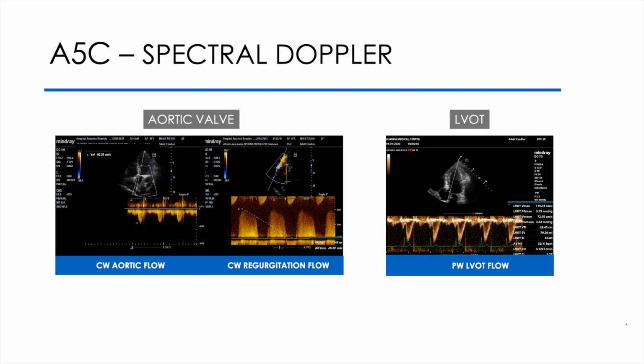How to evaluate a specific zone? I call Doppler PW cursor. I set the sample to 4 millimeters or less and place it where I want to evaluate, before the aortic valve, the aortic cusps. Then I call up the spectral graph by pressing the PW command again. And I get a flow that looks like this. Do not forget that we must orient the baseline and the velocity scale in order to visualize the peak of the curve. So I contour the systolic flow and the software automatically gives me the left ventricle VTI.